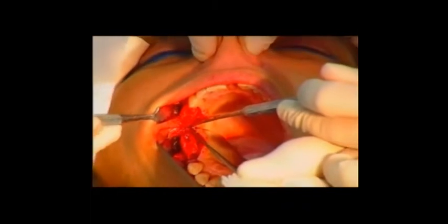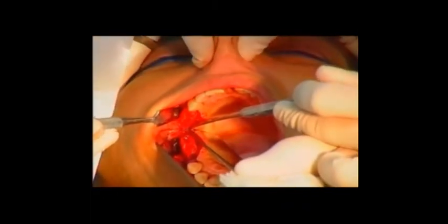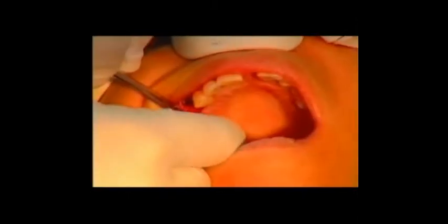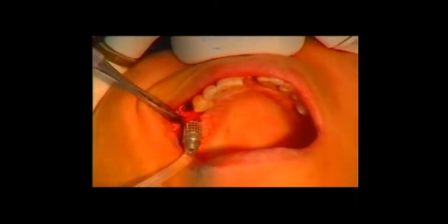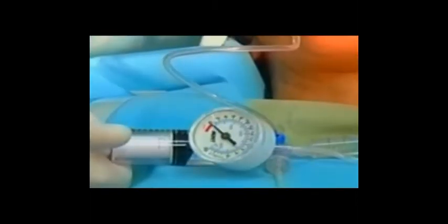The membrane integrity is reassessed by a Valsalva maneuver. The balloon harboring device is then inserted into the osteotomy one millimeter beyond the sinus floor, and the balloon is inflated slowly with a dedicated inflator.